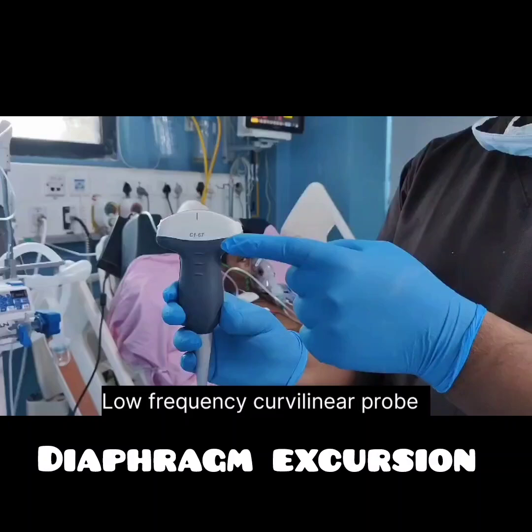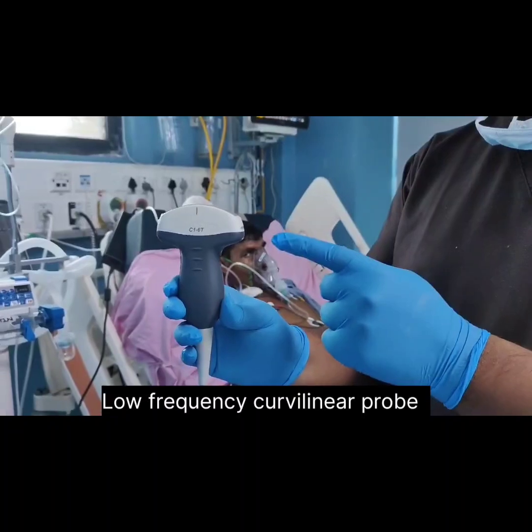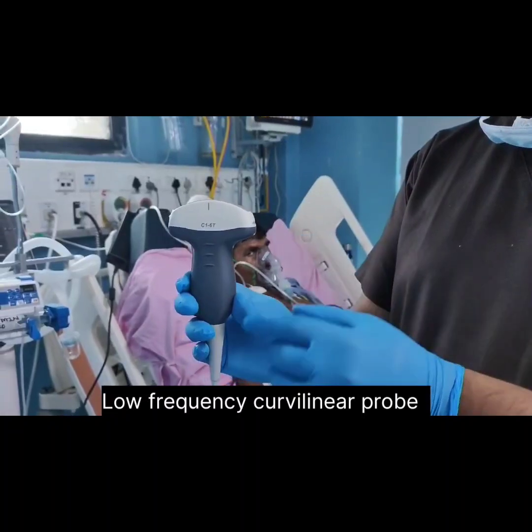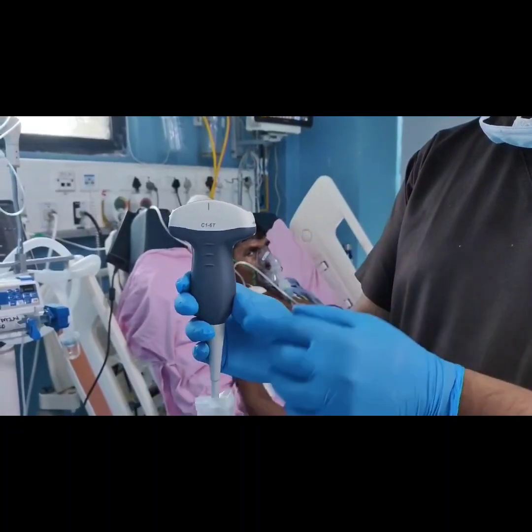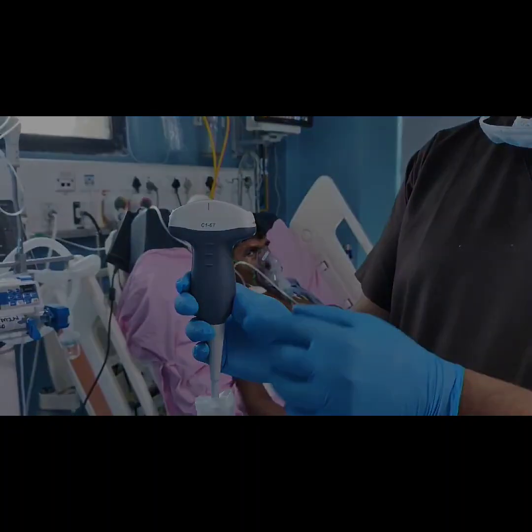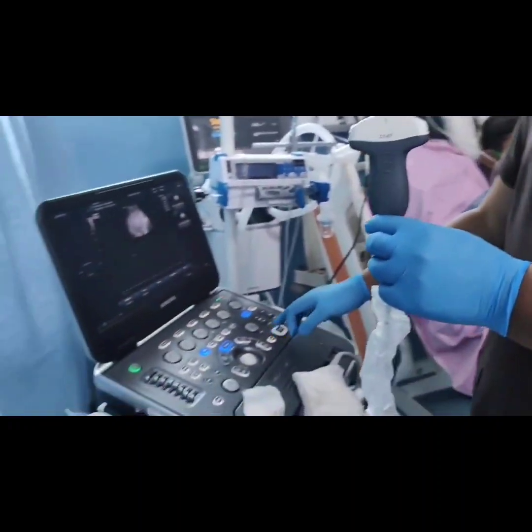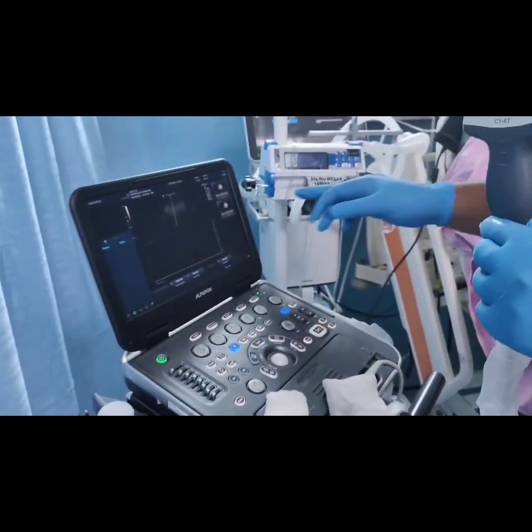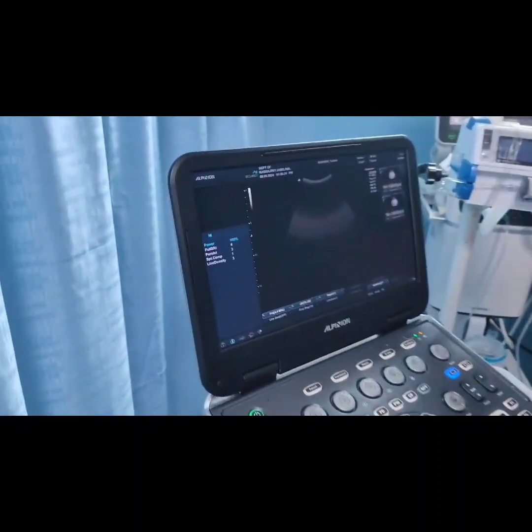For diaphragmatic excursion or diaphragmatic movement, we need a low frequency curvilinear probe. This is the low frequency curvilinear probe which we will be using to measure diaphragmatic excursion, and the patient has now been set up with this probe.